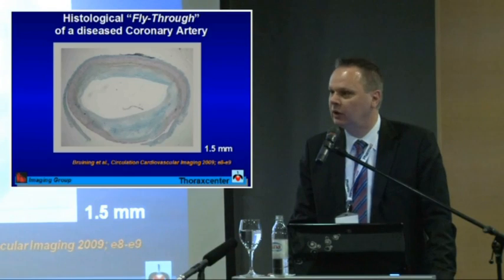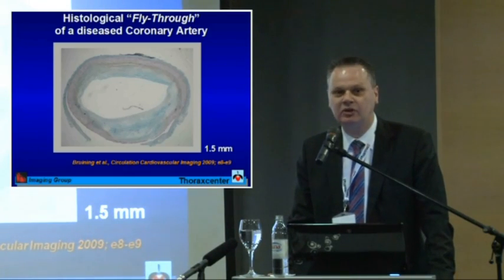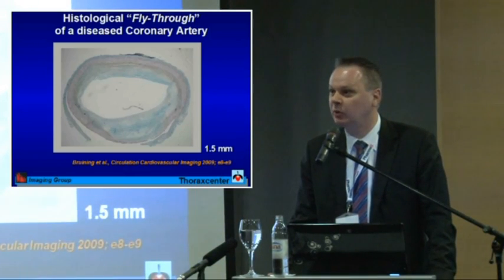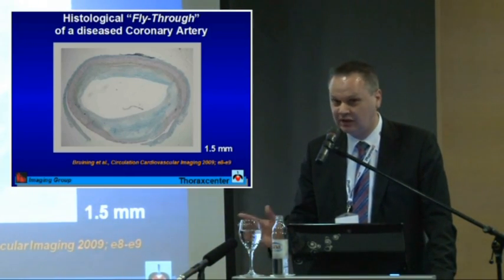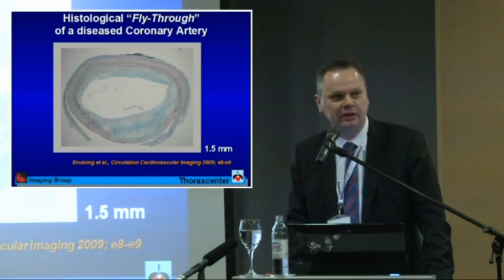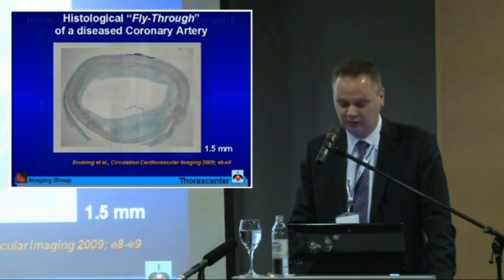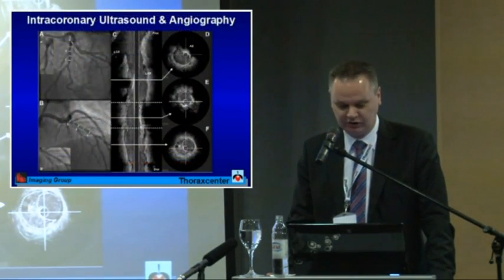Now if we evaluate treatment and the patients are coming back 6 months or 2 years later, we want to visualize the exact same spots. And you see that only a slice mismatch can result in different conclusions which we draw. So we have to be very accurate to image these kind of patients.